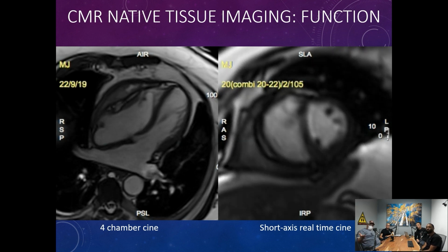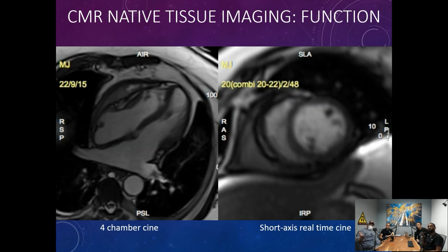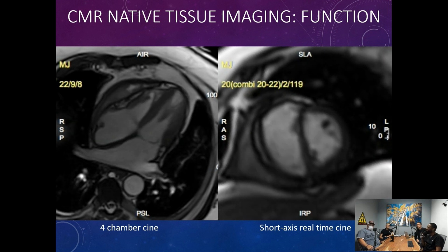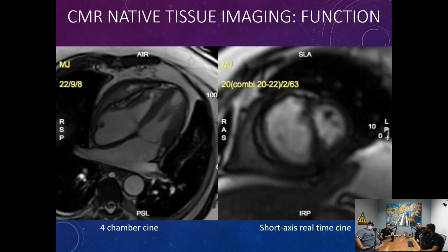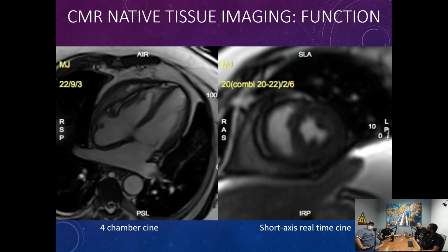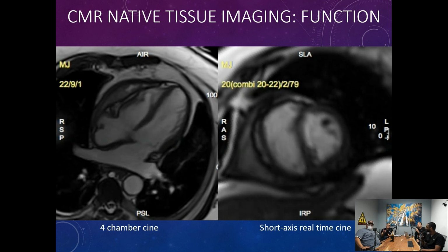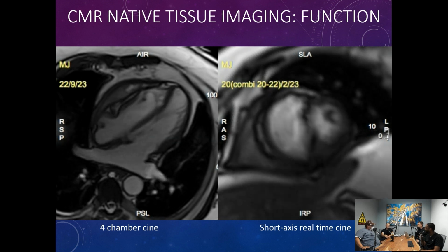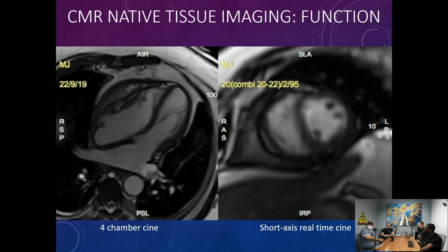So if we want to get a better temporal resolution and move away from a segmented k-space based filling algorithm and get real-time imaging, we can do that, but we're going to pay a price. The image isn't going to look as great. We're giving up some spatial resolution. These images were acquired with a 3T magnet, and again, you were wondering perhaps about the differences between 1.5 and 3T. Well, for us in cardiac, 1.5 is what I've used more. And we're talking about field strengths here. Field strengths, yeah.